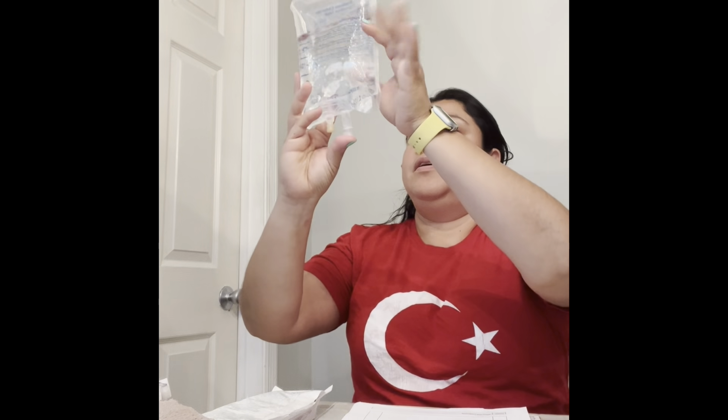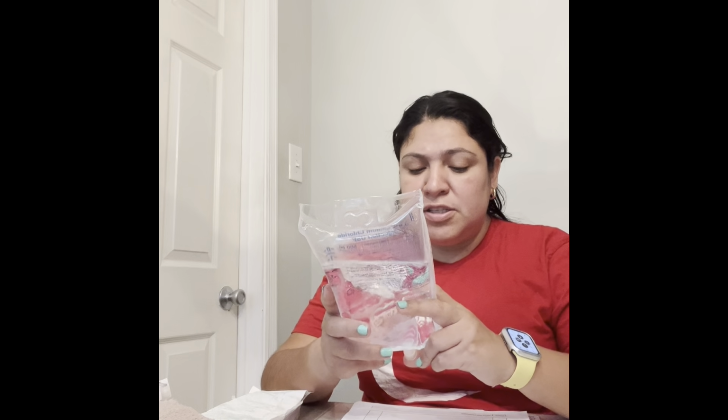I am going to start by washing my hands. Open the packaging of the medication. I am going to inspect my medication. There are no particles, not cloudy. Once again, my first check. Sodium chloride, 500 ml, to be administered continually every 4 hours via gravity using 15 drops per ml tubing. Time is now. By the math, it is 31 drops per minute. The medication is not expired. Expires January 25th.